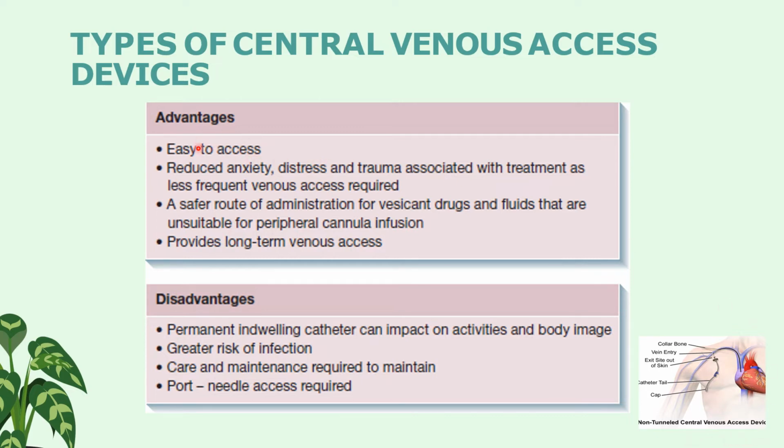For the advantages, it is easy to access. It reduces anxiety and the stress and trauma associated with treatment as less frequent venous access is required. It is a safer route of administration for vesicant drugs and fluids that are unsuitable for peripheral cannula infusion. It also provides long-term venous access.